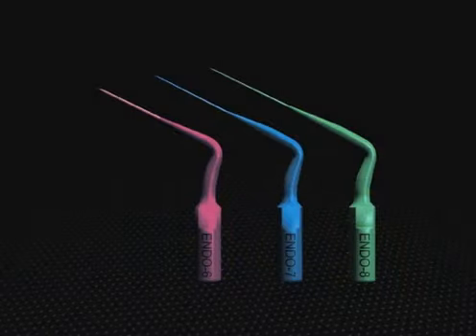The Pro Ultra Endo 6, 7, and 8 ultrasonic instruments are made of titanium to provide clinicians with thinner diameters and longer lengths as compared to the Endo 3, 4, and 5 instruments.